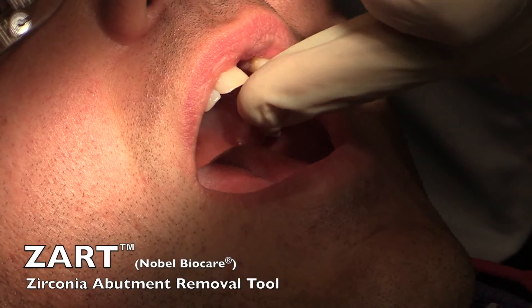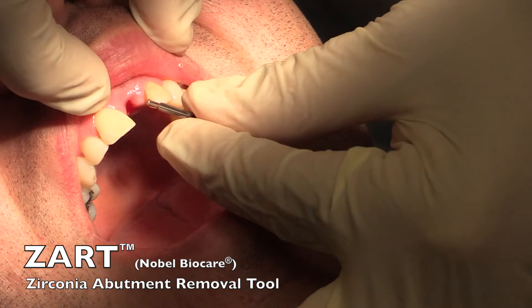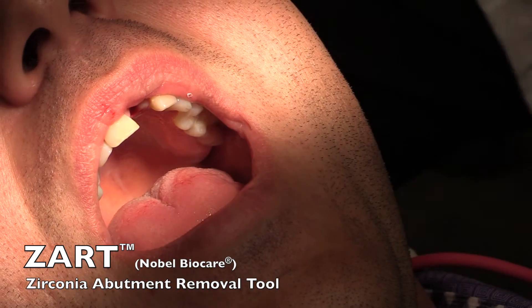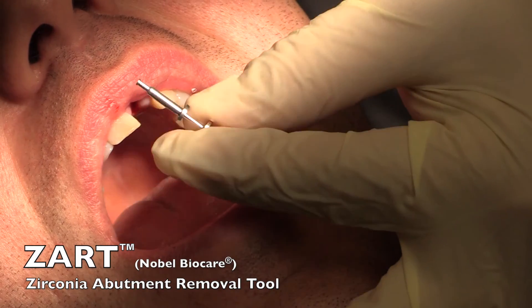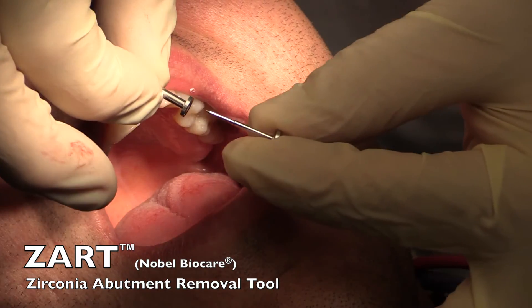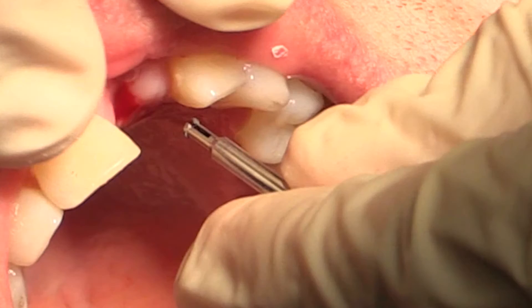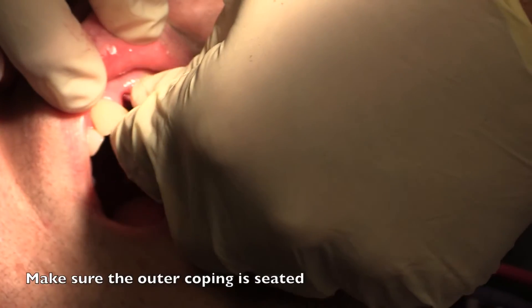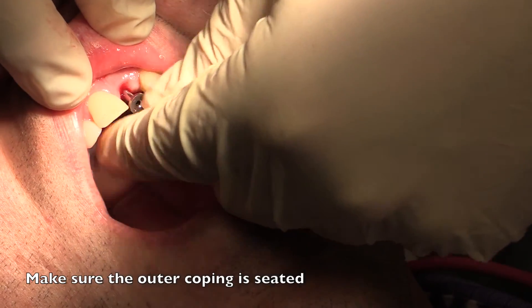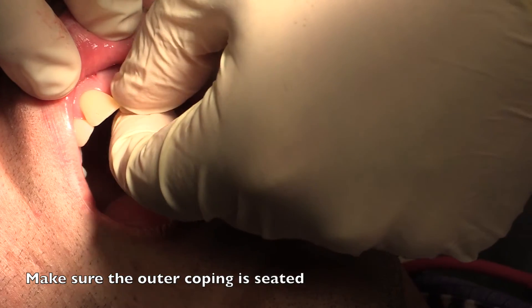Our goal is to get this zirconia abutment piece out with the ZART. We're going to take the ZART — it's a two-piece structure, almost like an impression coping. It has the outer coping and then a center pin. When you take it apart, you'll notice it has a coping aspect with two wings on it. These wings lock down underneath the abutment, going right underneath the hex. As you stick it in, you can feel it engaging underneath the hex, and if you wiggle it, you can feel that.